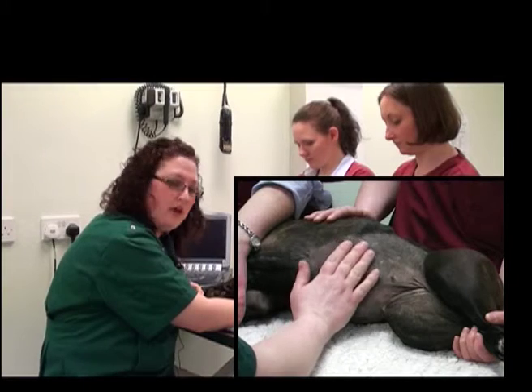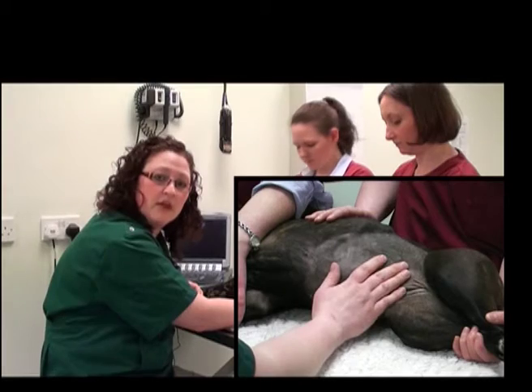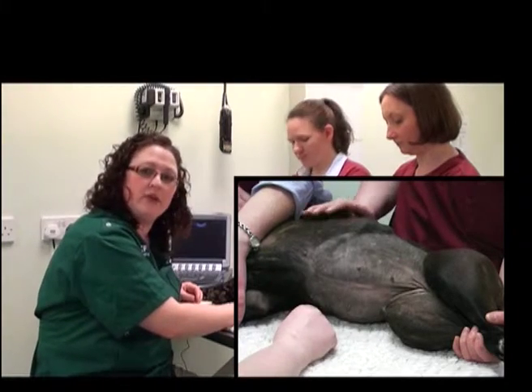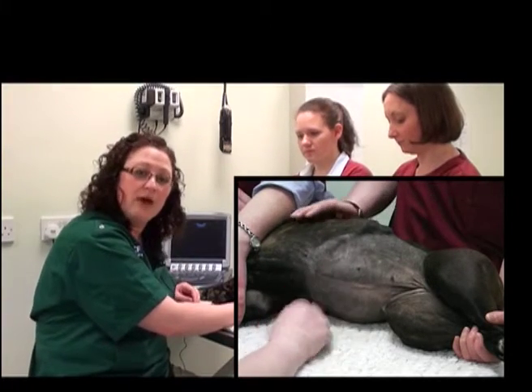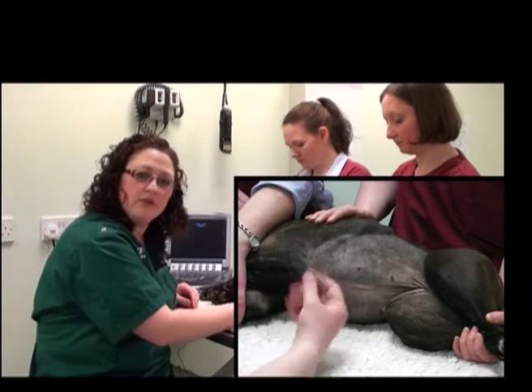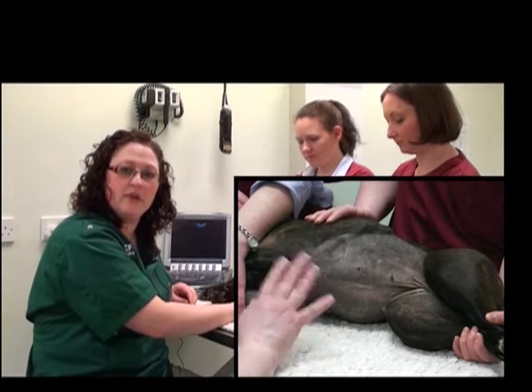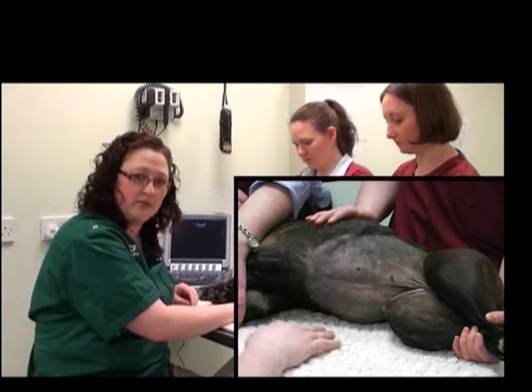You also want to place a good amount of ultrasound gel on the surface of the skin. What can really help is to allow that to sink in for about five minutes before you actually start your examination. This will allow it to soak into the skin so that the first initial images you get are as good as they could possibly be.